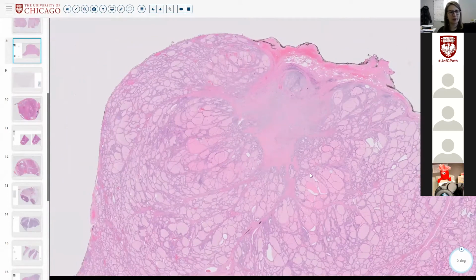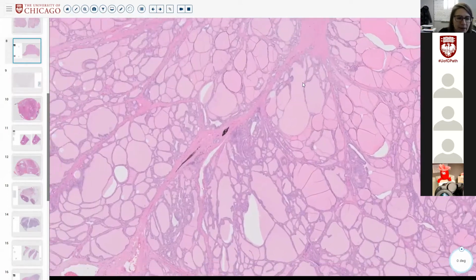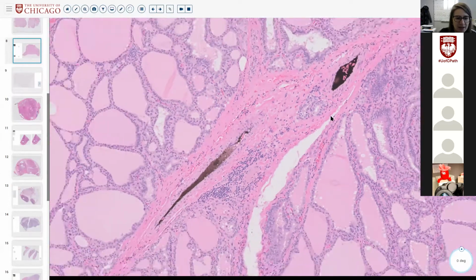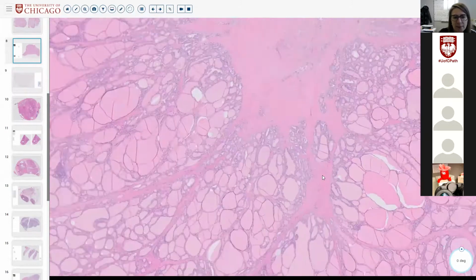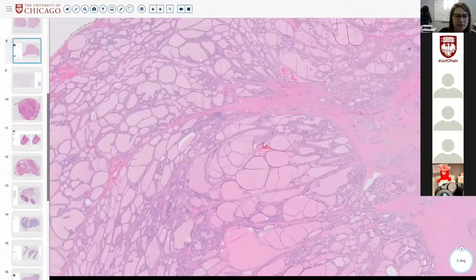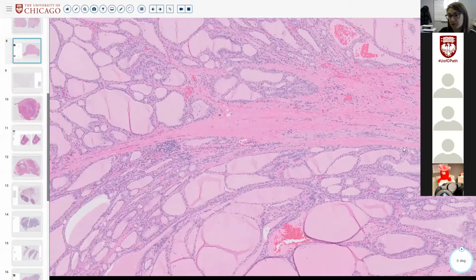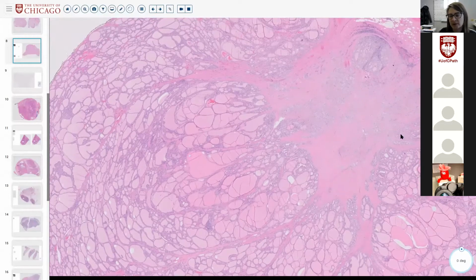I know it's flipped the opposite direction, but let's go back and look in those tendrils, and maybe now you can follow them and see, oh, maybe even some of these nests are cancer that were lighting up in those kind of fibrous tendrils. So I think this is a good example of a scar-like or a sclerosing papillary thyroid carcinoma that can be very subtle. In this case, BRAF worked very nicely. It may not work in all cases because only 80–85% are positive.